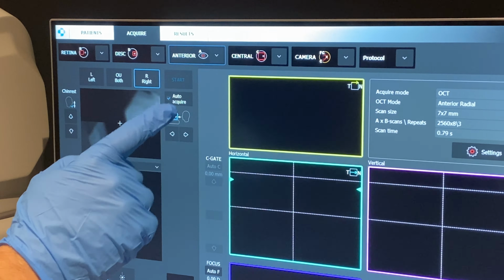So that's single eye, and you do the same in both eyes because the tomogram there is at the bottom, so I can roll through it, centre back over the fovea. If I put the padlock on, when I roll through one image, it'll automatically do it on the other eye as well.